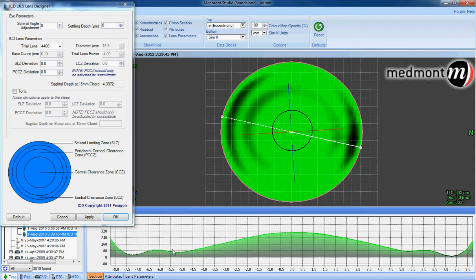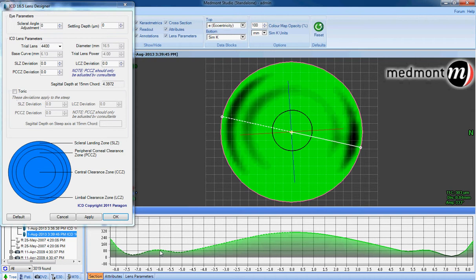We can also observe the amount of fluid through the peripheral cornea and limbus. If the average visible iris diameter is 11.8, then very close to 5.5 to 6 millimeters out we should see the vaulting that exists through the peripheral cornea and limbus. In this case, there's under 80 microns of fluid very near to the sensitive zone.